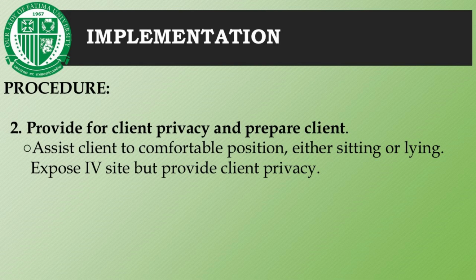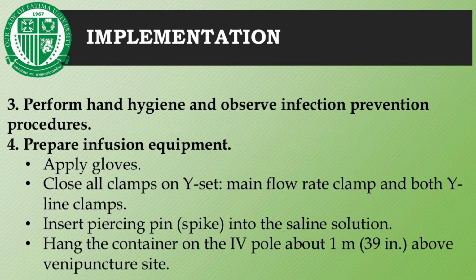Next is to provide for client privacy and prepare the client. The nurse should assist the client to a comfortable position, either sitting or lying. Then, expose the IV site while still providing client privacy. Perform hand hygiene and observe infection prevention procedures.